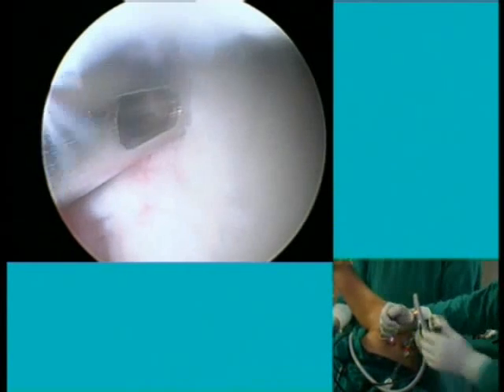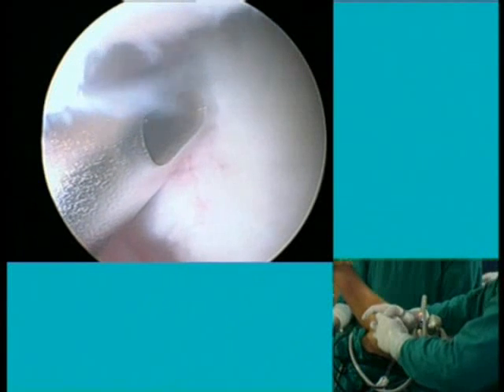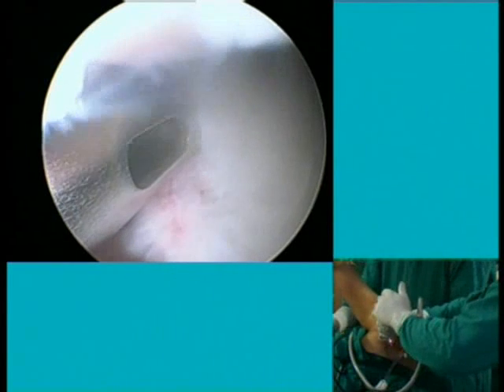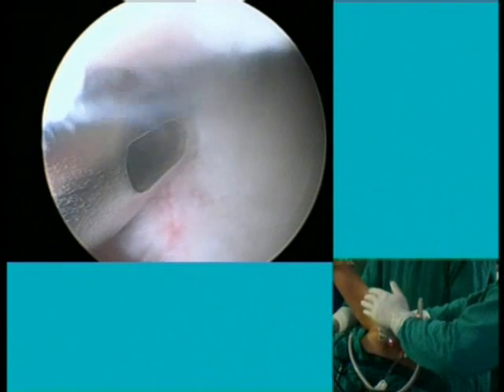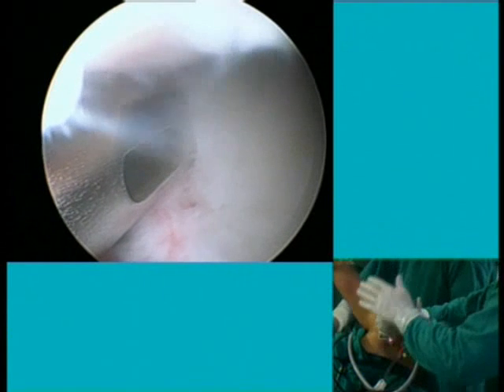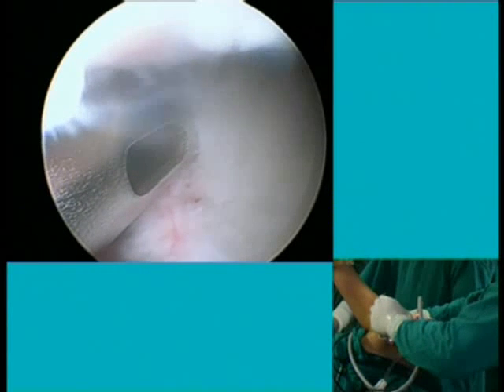Although you're putting it on the face of the glenoid. I am putting it more resting. I am on the face, but not much on the face. Ultimately, my sheath is resting on the edge, and I am going to be on the face with the anchor, but not too much in. And I don't have any glenoid erosion here, so I don't have that issue.